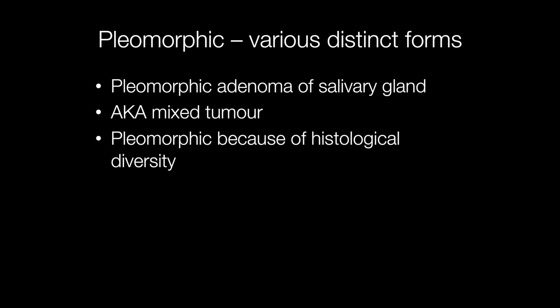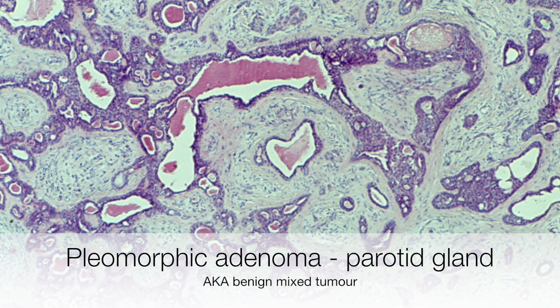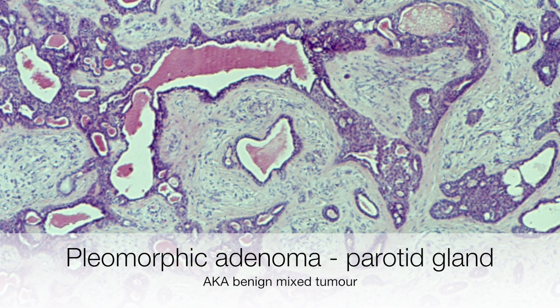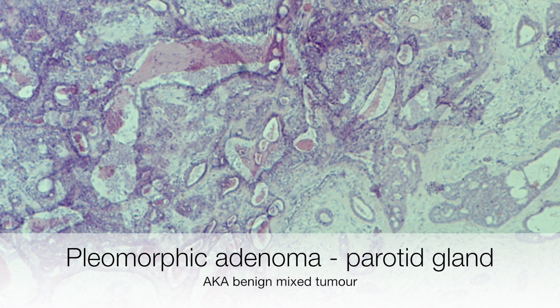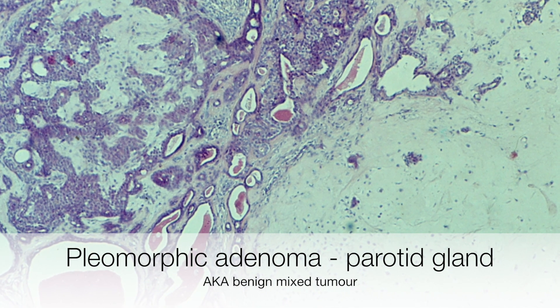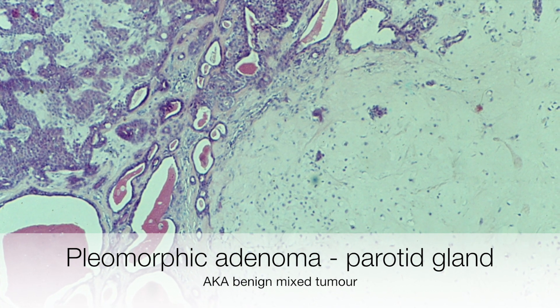As the name would suggest, pleomorphic adenoma or mixed tumour of the salivary gland is a really good example of pleomorphism in a tumour, and the term pleomorphic is used because of the histological diversity. Here is a pleomorphic adenoma and it can clearly be seen that there is architectural diversity within the tumour. On the left there is a proliferation of benign epithelial cells and towards the right there is mature benign cartilage.